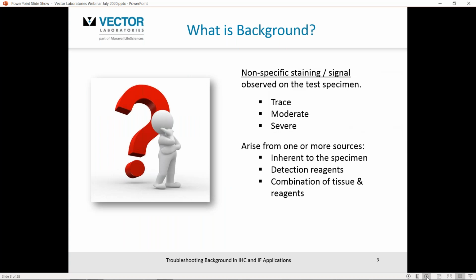So what is it we refer to when we're talking about background? It's non-specific staining or signal observed on the test specimen. Now, this may be observed as a trace or a weak staining, possibly as a toning across the section, or maybe just some isolated cells. It may be a little heavier, a moderate type of expression, and I'd have to say that most investigators would probably face either trace or moderate background expression in their preparations. If they do see severe background staining, toning, I would say that more than likely there's something fundamentally wrong with the assay setup.